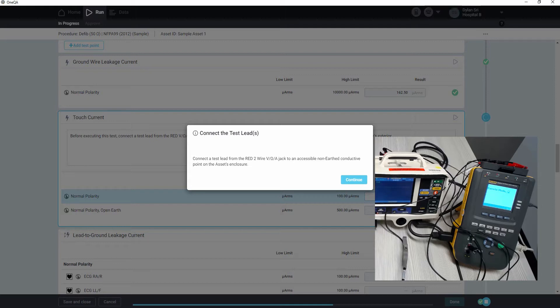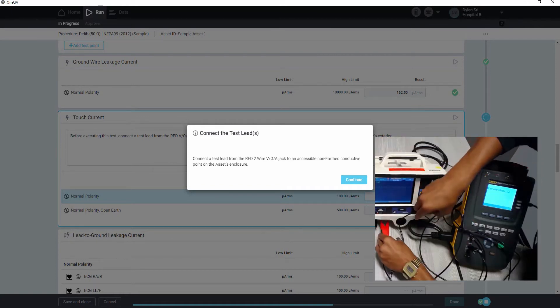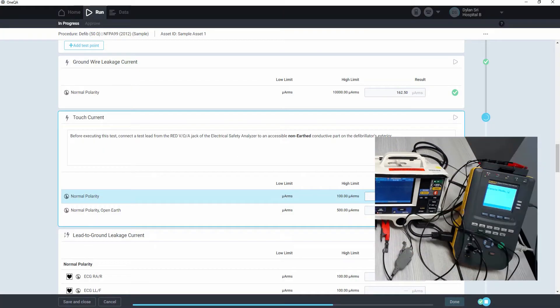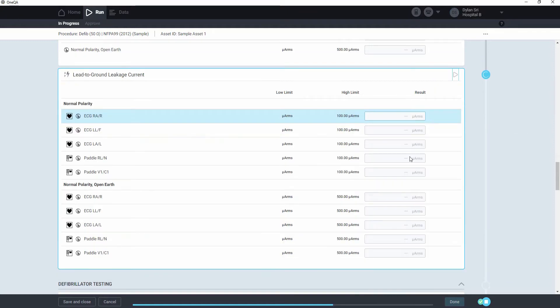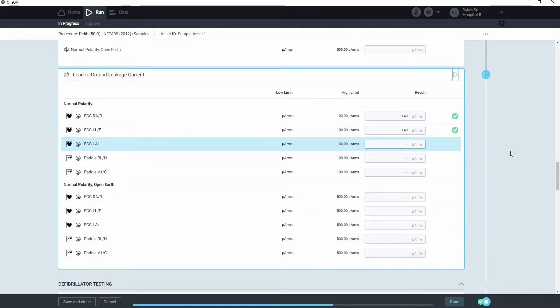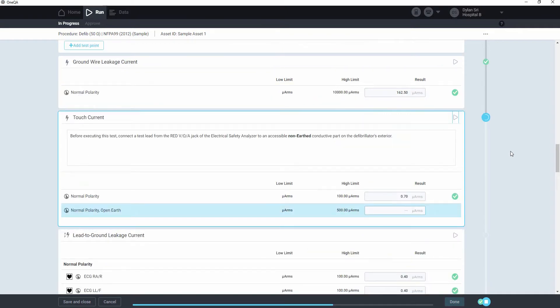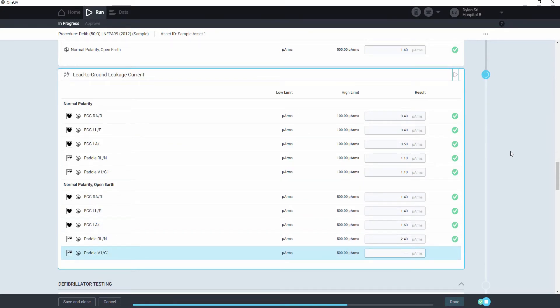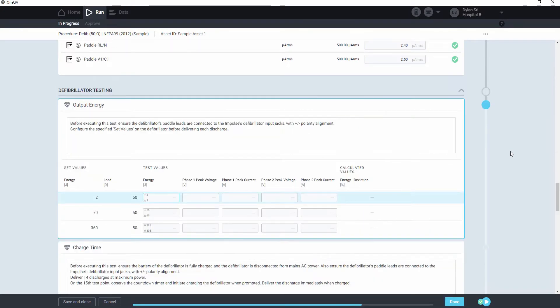Then we want to reconnect the test lead to a non-earth point, like this. Proceed. So once the electrical safety tests are complete, we'll start with the defibrillator testing section.